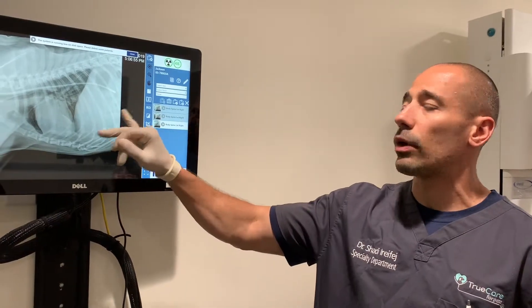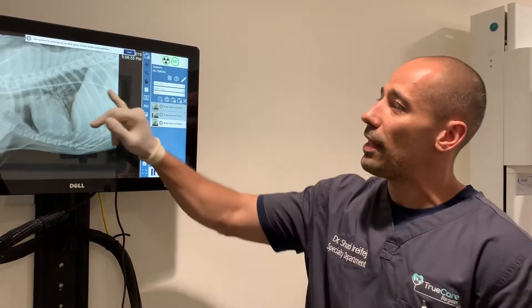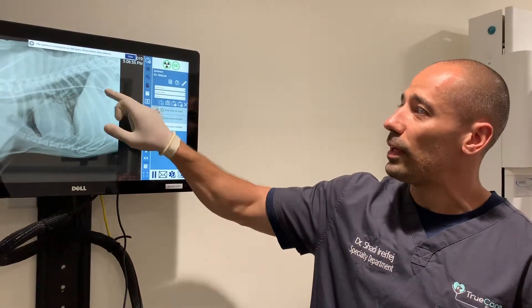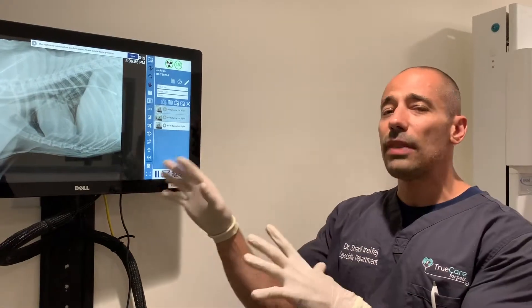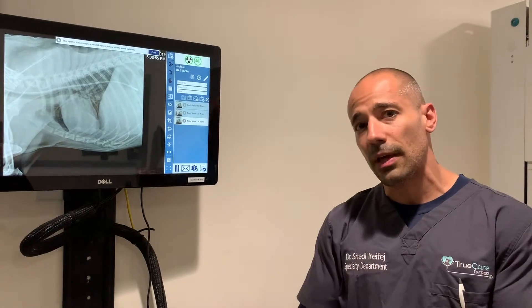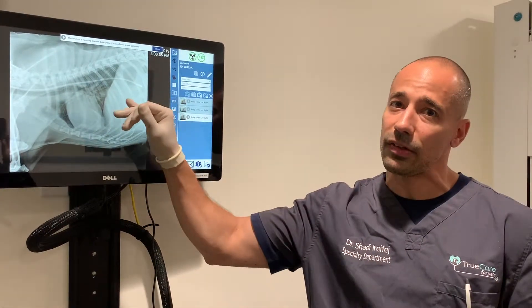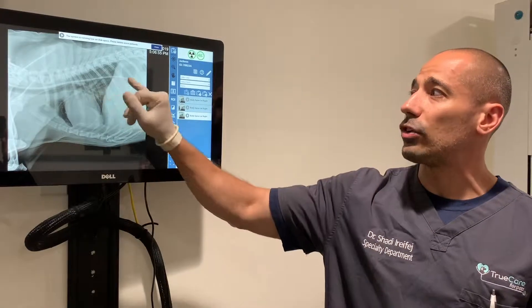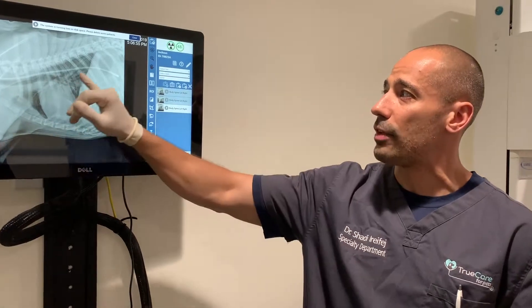However, if this is a patient we weren't worried about constant vomiting and didn't need to remove fluid from the stomach, we could end the feeding tube just before the diaphragm — that way we don't enter the distal esophageal sphincter. When you enter that sphincter, the junction of esophagus to stomach, you're more likely to get reflux. But in this scenario, we really want to make sure that if Jackson is starting to build up fluid in his stomach we can remove it and simultaneously feed him. So we're going to risk the reflux esophagitis — basically heartburn — because we really need to empty out his stomach since he's here for vomiting.